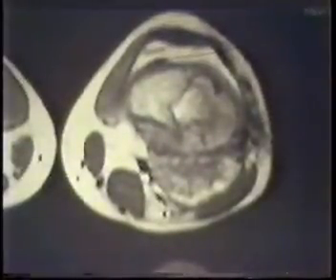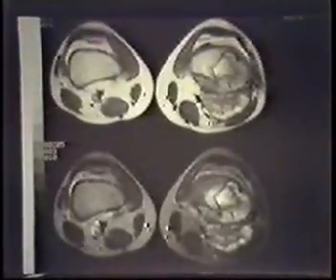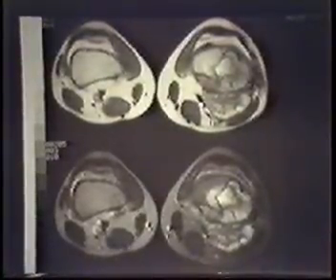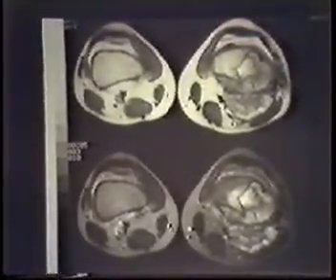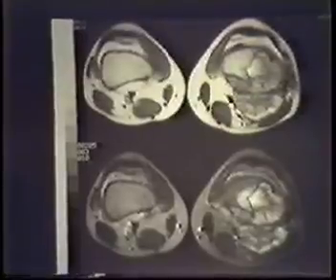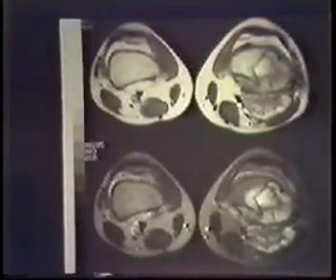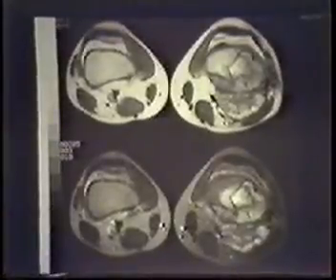Yes? As in the brain, can you tell the actual tumor from other things like edema, and how do you know exactly? Oh, terrific. Once you get out of the brain, MR is fantastic. In the brain, there have been a number of pathologic studies which have compared pathology with MR findings in extent of tumor, and MR outside of the brain can determine the margin of tumor and is very reliable at doing that. Inside the brain, it's just not very good. What can I say? Probably it's because they're very different diseases, really.